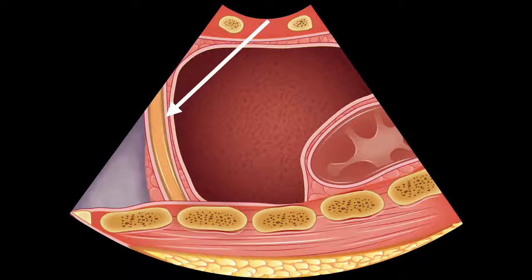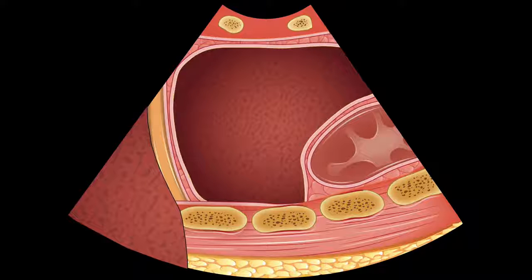So what happens is sound beams leave the probe, impact the diaphragm. If there's aerated lung above the diaphragm, it reflects very well, and that sound beam is reflected into the liver. That sound beam hits liver tissue, and then is redirected to the diaphragm and reflected back to the probe. However, the ultrasound machine assumes sound travels in a straight line, so all of that sound is then plotted out in a straight line, and it assumes that liver is now above the diaphragm.